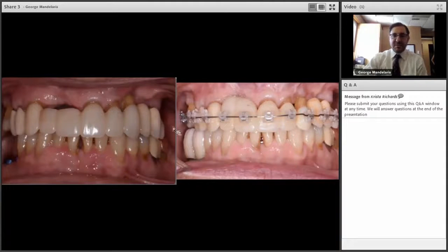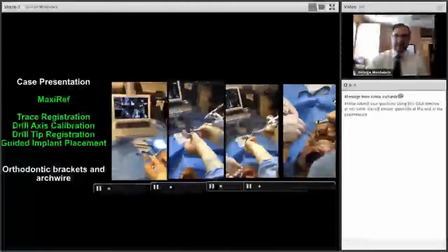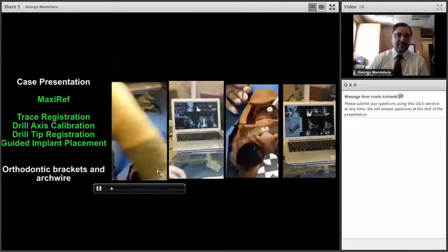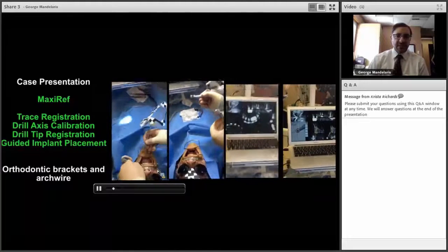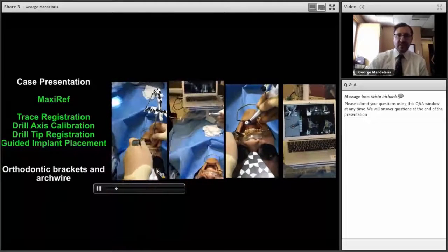This is a patient who has full provisionals. He's going to obviously lose this tooth, but we were able to use the orthodontic ligature to trace. So again, I'll walk you through a couple of quick movies here, just to show you the simulations, and we'll get into treatment in the maxilla at the next webinar, and then treatment of the mandible later on. But again, everything comes back to the planning. So just because we can do this on the same day, don't shortchange the treatment planning, and don't shortchange the prosthetic need to really have that information in your plan so that you have an excellent result.